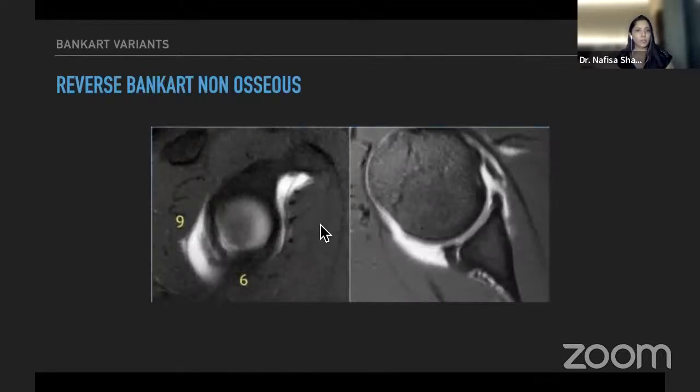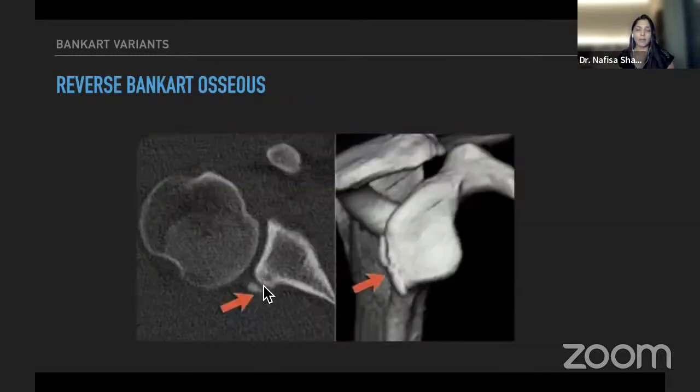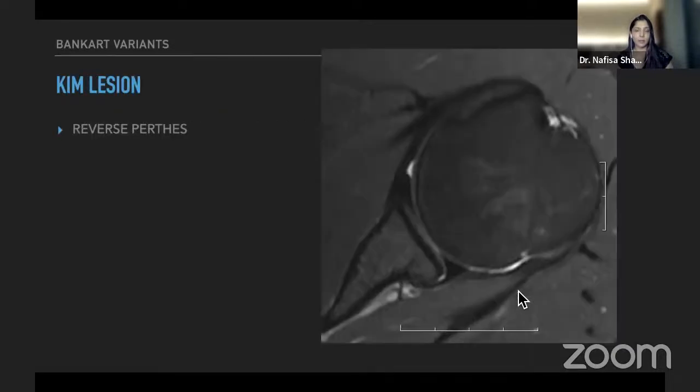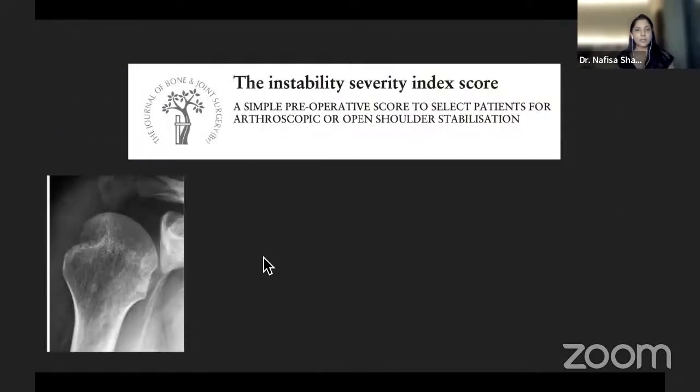Similar is true about posterior instability. So you can have posterior labral tears like these, or you can have a reverse Bankart osseous tears like these, or a POLPSA lesion, which is the analog of the ALPSA lesion, where there's maceration of the posterior labrum, or a Kim's lesion, again, a pouch formation. And this is an analog of the reverse Perthes lesion.